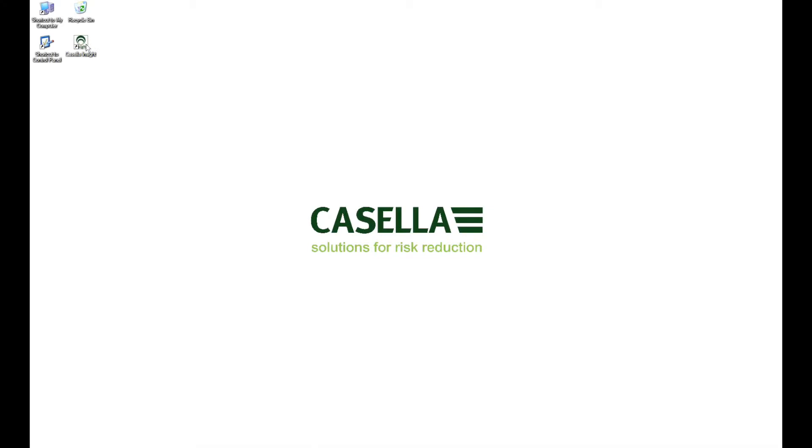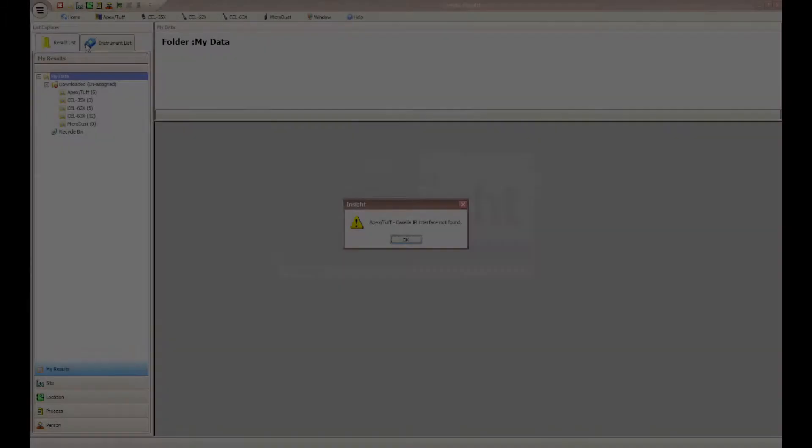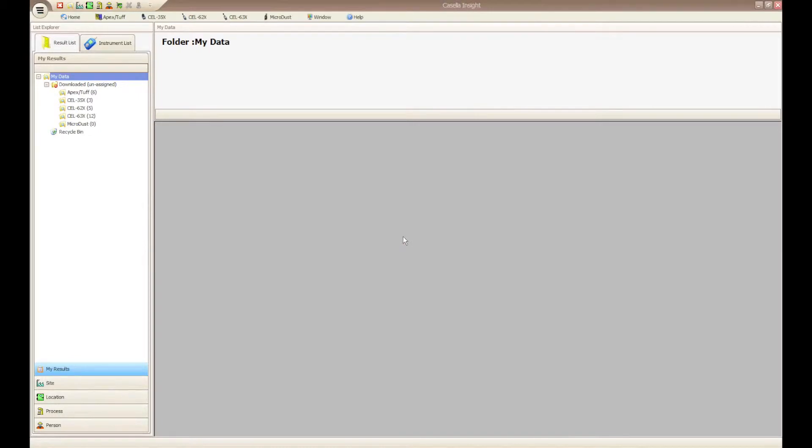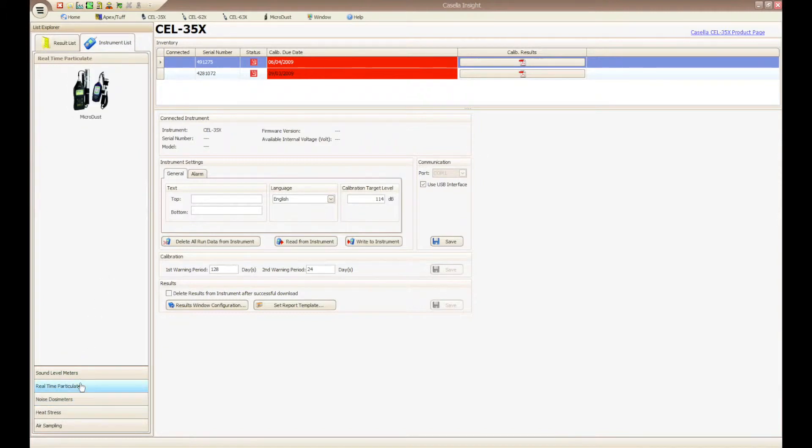To begin the process, open Casella Insight and after the software has loaded, click on Instrument List, Real Time Particulate, and then the image of the Casella MicroDice Pro. This will initiate the relevant plugin within Casella Insight.